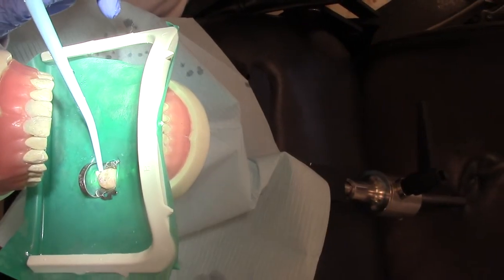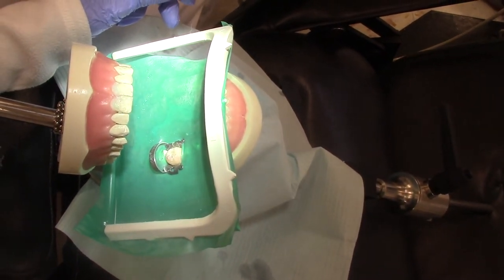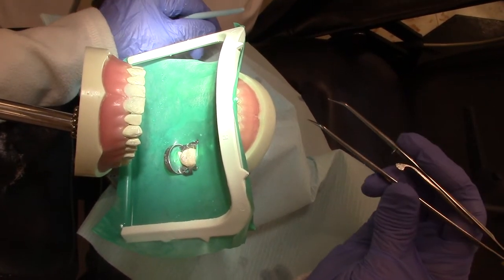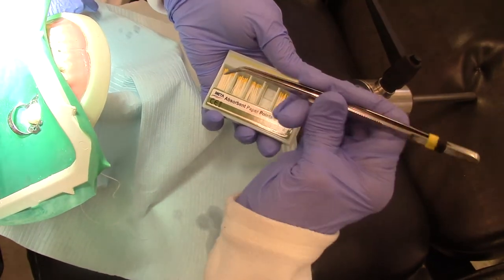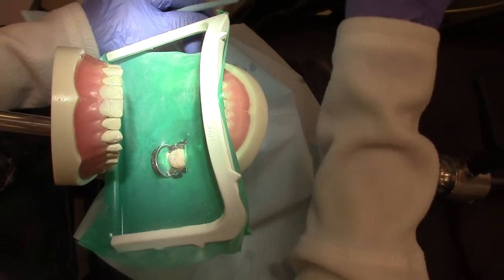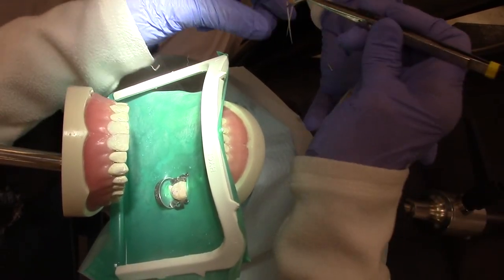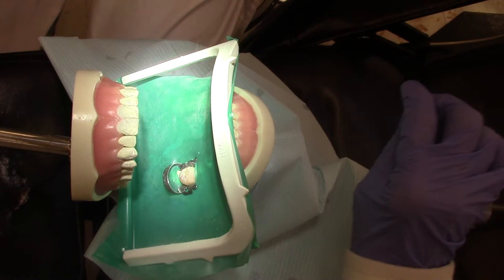We're going to dry this off and now we are going to do paper points. Beth, can you give me the paper points? Each one of the paper points will be taken out, put inside the canal, and dried, and then given back. We would do this with the paper points until the canal is completely dry. All right, so we are dry.